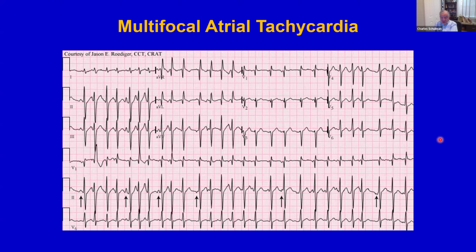Now these are usually very sick people. They're in the ICU, on respirators. So it's a kind of special population. You're not likely to see a patient with an ECG that looks like this walk into the clinic. Pretty unlikely.